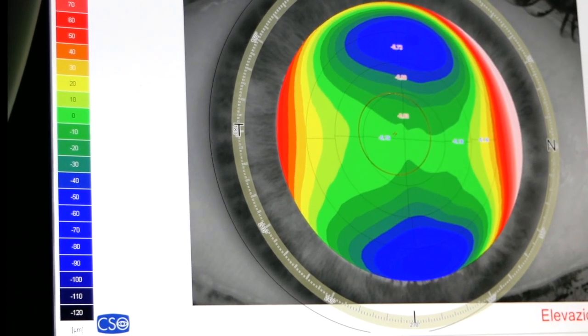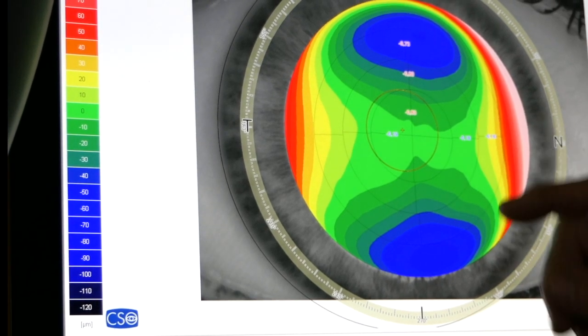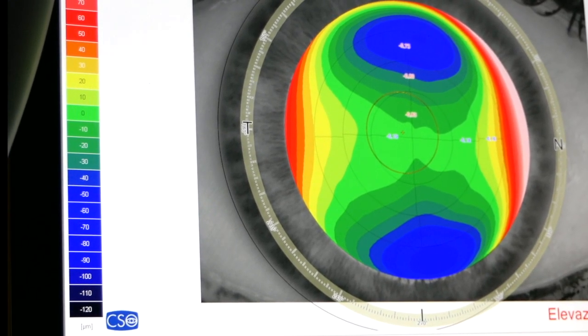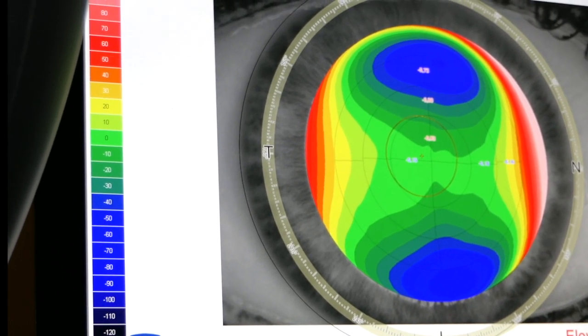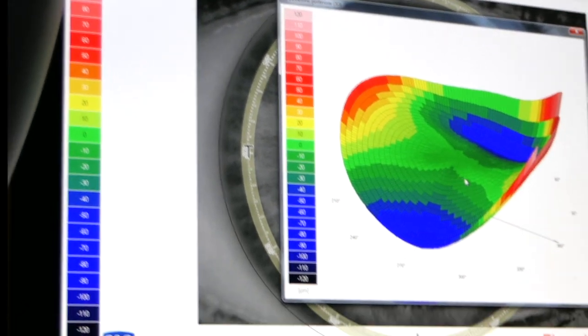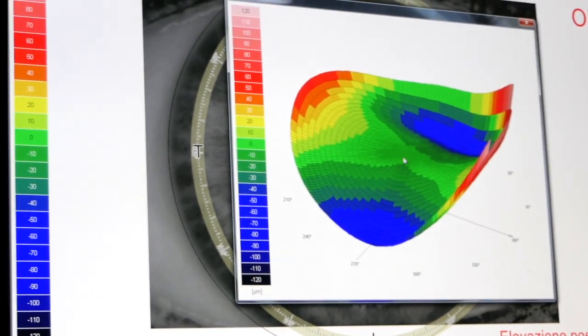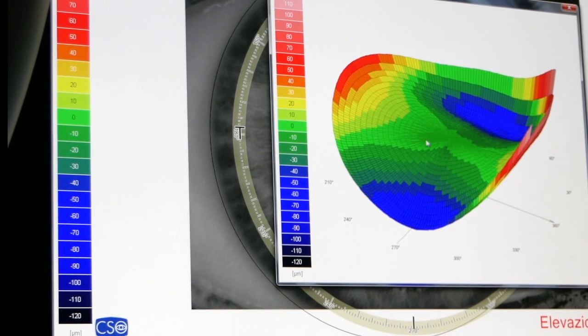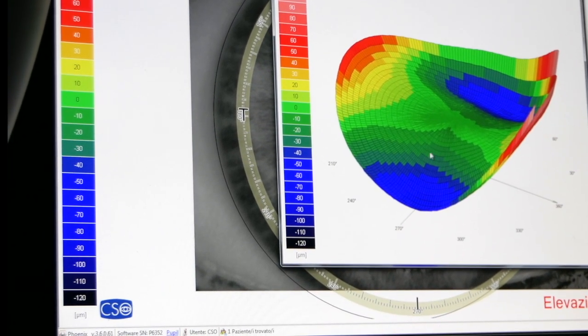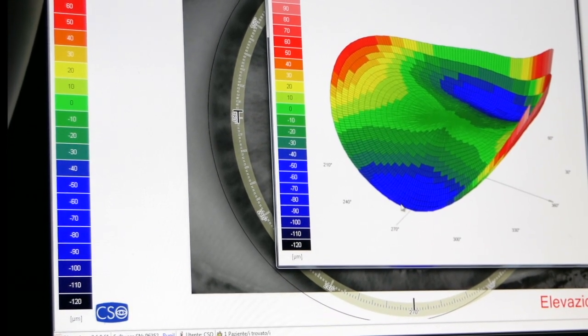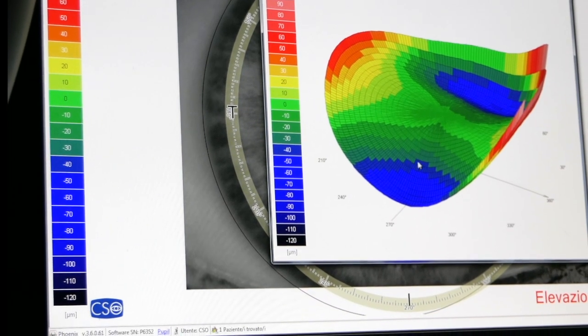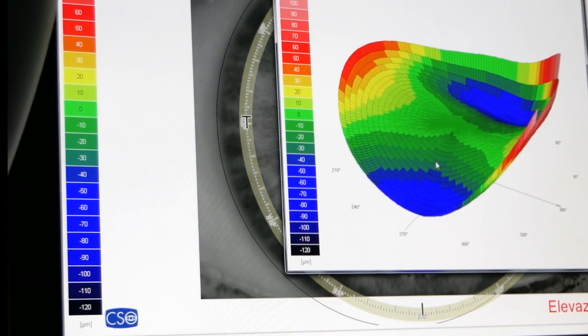The same thing can be done with the posterior cornea, that is with the face of the cornea looking towards the inside of the eye. Seen in three dimensions, we can understand that the posterior cornea is curved in this central green portion. Then later, it has two parts.